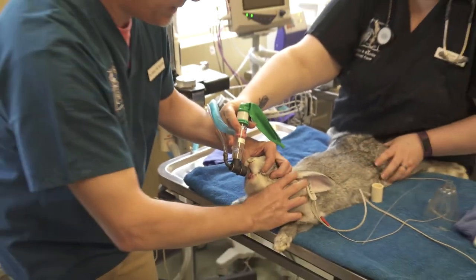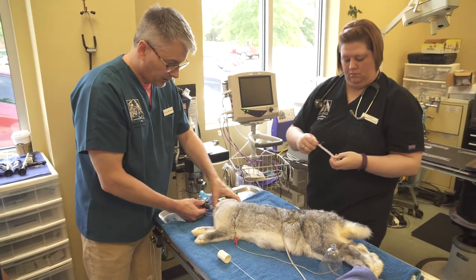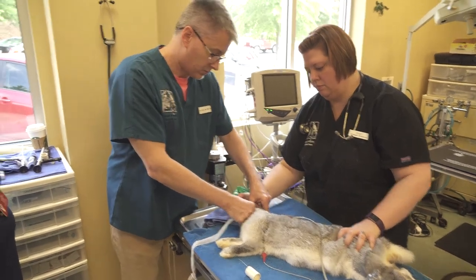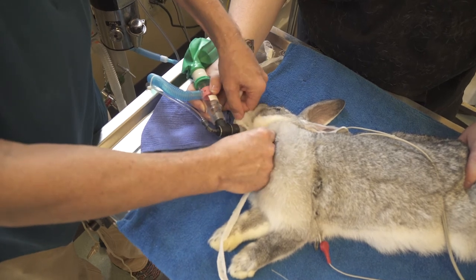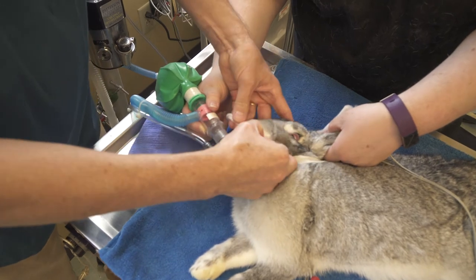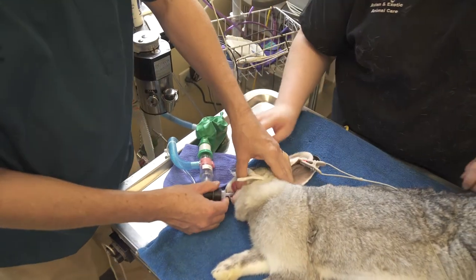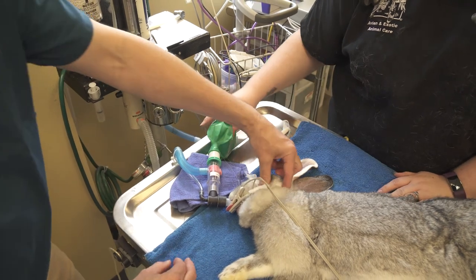Now we're intubated, and we're going to turn the rabbit sideways. This is the step where we tie it in using tie-in gauze. You go back to the corner of the mouth with your tie-in. We tie in maybe one centimeter back from the junction between the adapter and the endotracheal tube. Most important: when you pass this gauze through the mouth, make sure that the tongue is ventral to your gauze so that you continue to use the tongue for pulse oximetry. If the tongue is above the gauze, it's going to get choked. The tongue can now be used for pulse ox because it's unencumbered by the tie-in — it's not going to be strangulated.